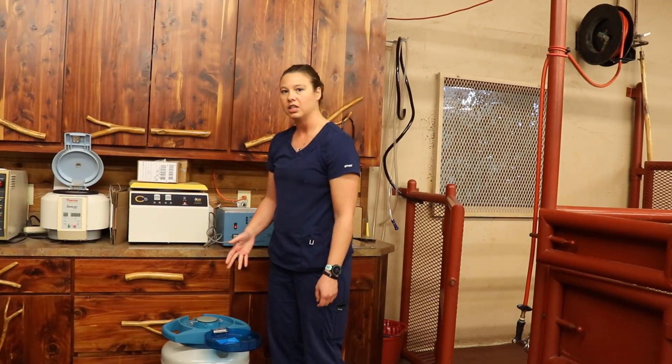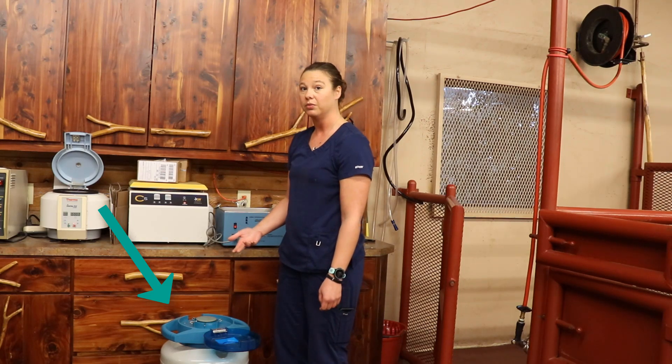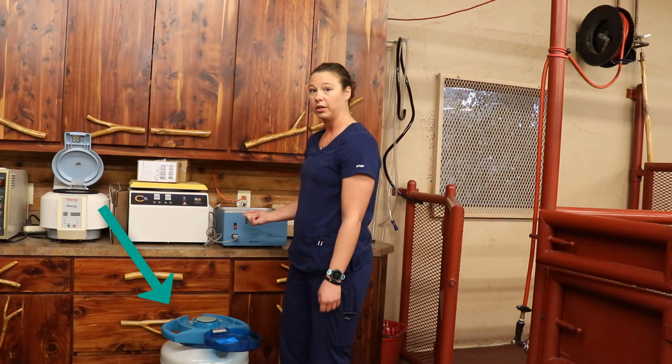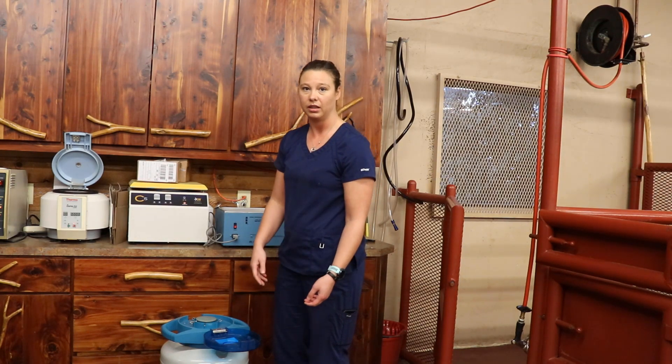Our frozen semen is stored in a liquid nitrogen tank. We're going to take out the straws we need for breeding, put those in a water bath to thaw, and then transfer it into the syringe and pipette that we'll use to inseminate the mare.